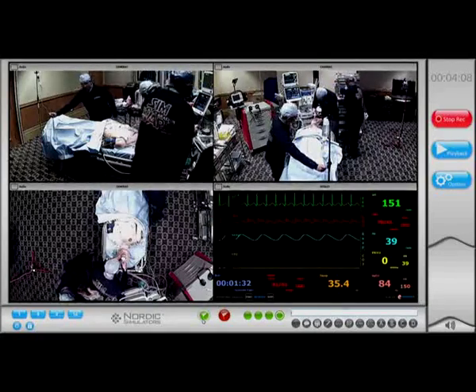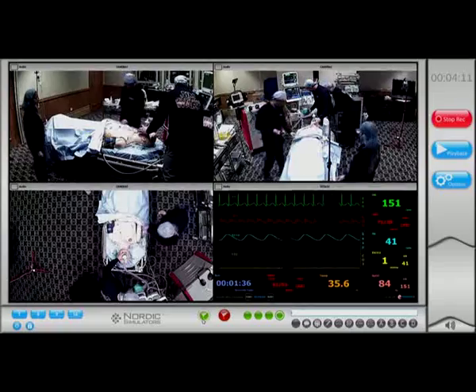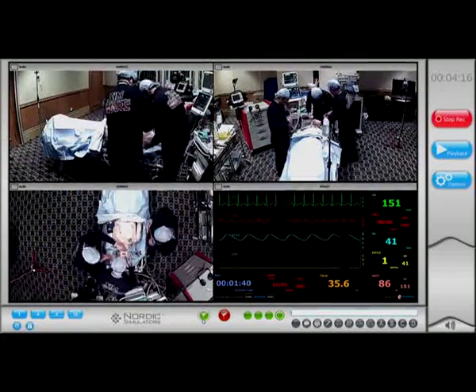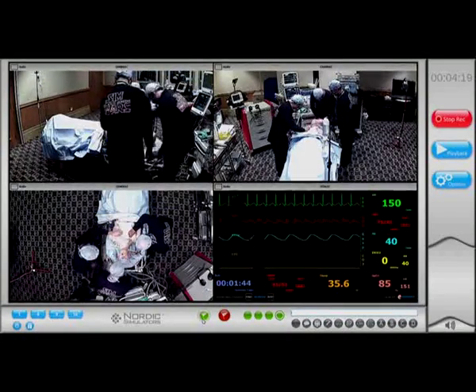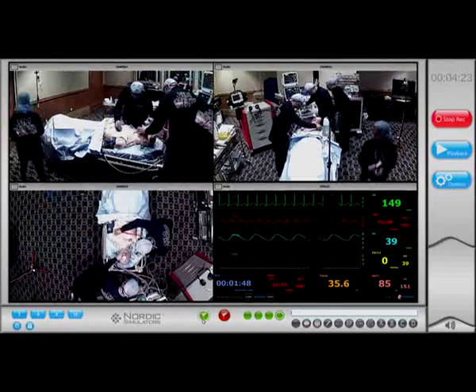This is running. Okay, sir. Let's start another line on the other side. Oral airway, please. Oral airway, doctor. I can't hear any breathing. You'll have to ventilate him. Just ventilate him. Now ventilating. Yeah, good.